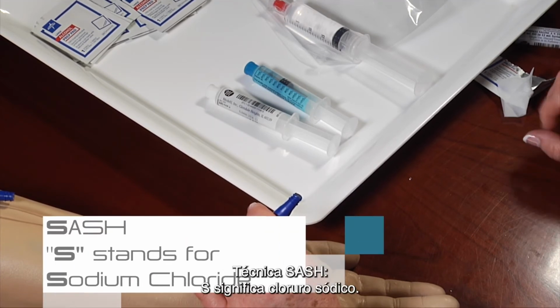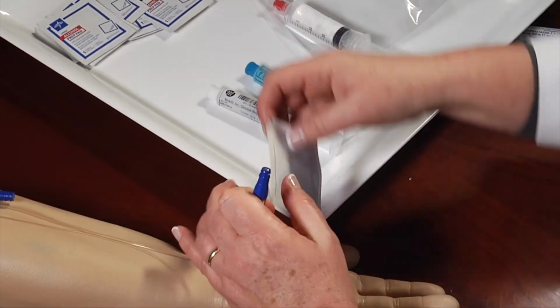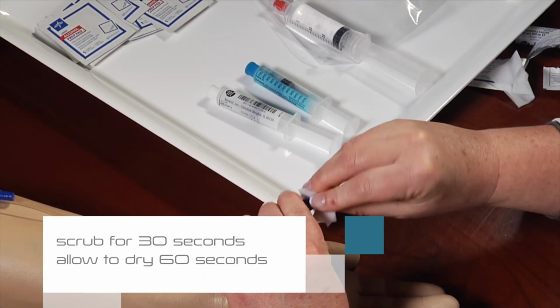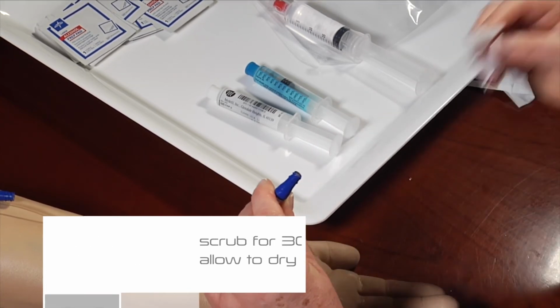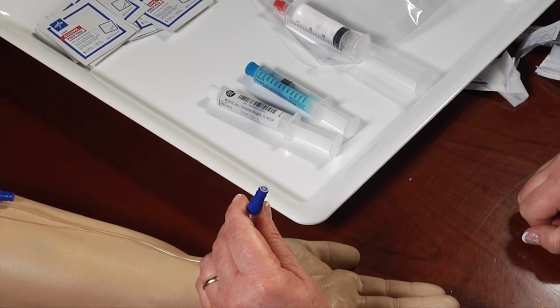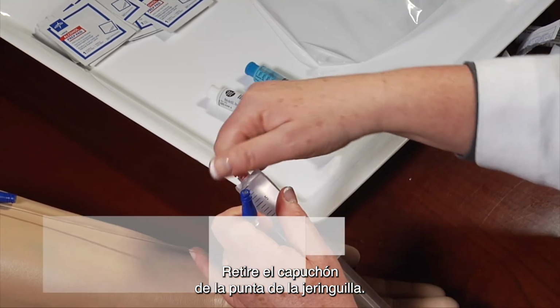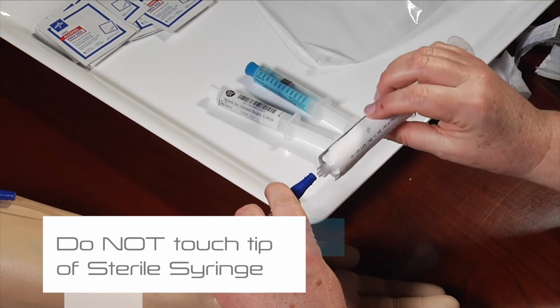SASH method. S stands for sodium chloride. Scrub the hub of your injection cap vigorously for 30 seconds with a new antiseptic wipe. Allow to dry for 60 seconds. Remove the cap assembly from the end of the syringe. Do not touch the tip of the sterile syringe.